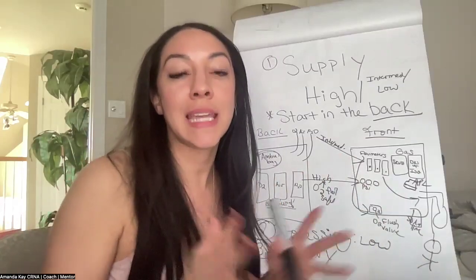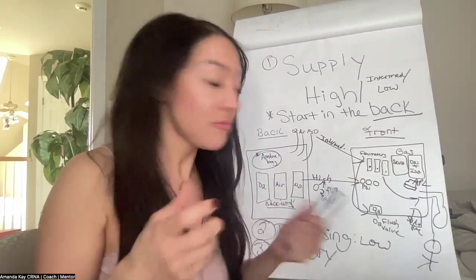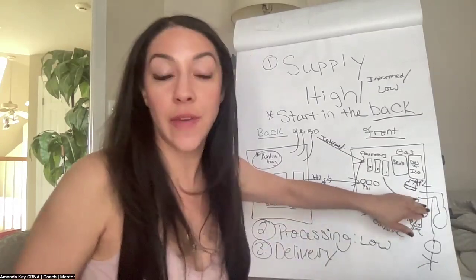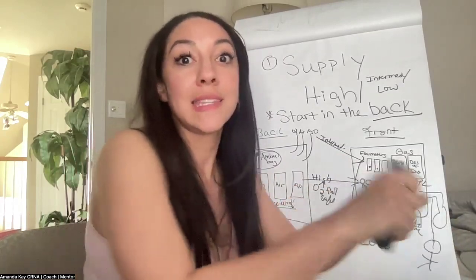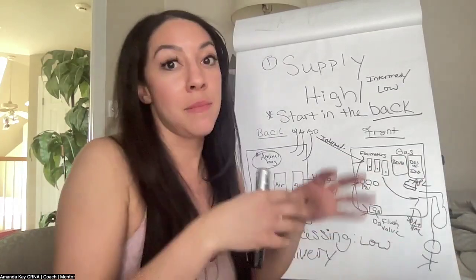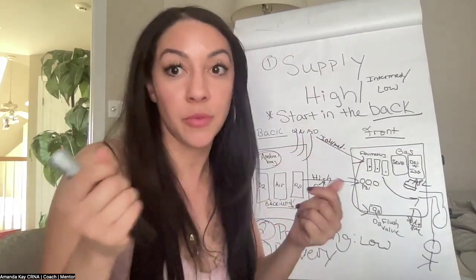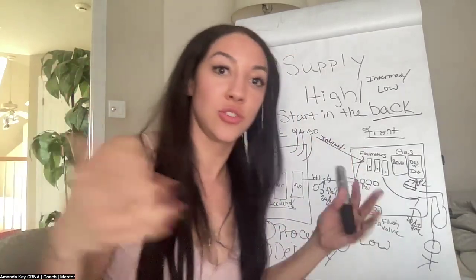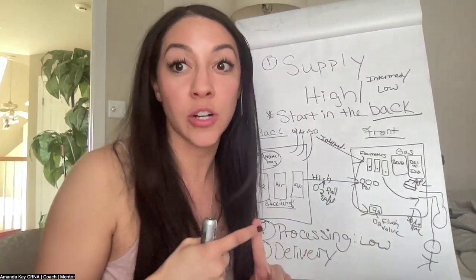Okay. And again, I just can't say this enough, especially because I work solo a lot using different machines. If you're experiencing any circuit leaks, the first thing you want to do is check: did anything disconnect? You have expiratory and inspiratory limbs that you hook your circuit up to. Is anything disconnected there? Did it disconnect from the patient? That's happened before under the drape. So the surgeons are like, I can smell gas. I'm like, oh no.